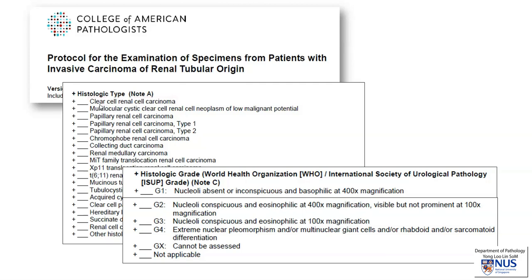So first of all, the histologic type — this is a clear cell renal cell carcinoma. Secondly, in terms of the grading, we looked at 10 times objective, which is equivalent to 100 times magnification, and the nucleoli are not conspicuous. For grade 2, the nucleoli are conspicuous at a higher magnification, but at 100 times they are just visible and not prominent. So this tumor is a grade 2 tumor, and we would typically look at the worst possible area, so we need to examine several different slides to get a better idea of the tumor. In summary, this is a clear cell renal cell carcinoma, Fuhrman grade 2.